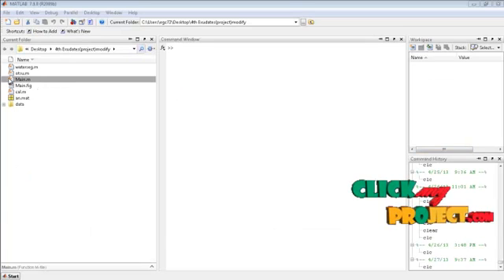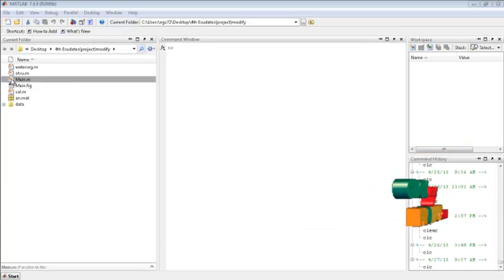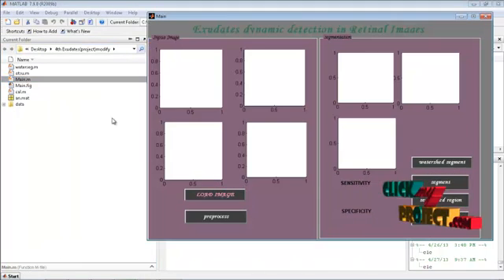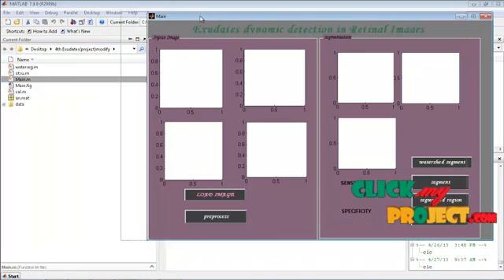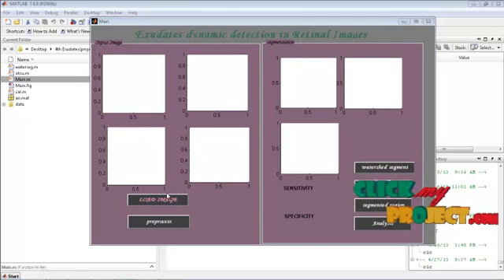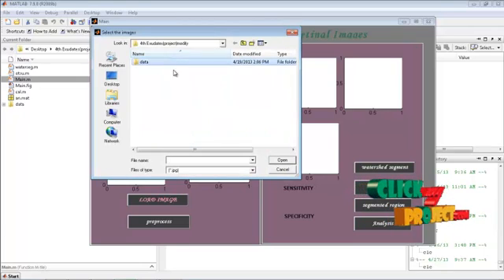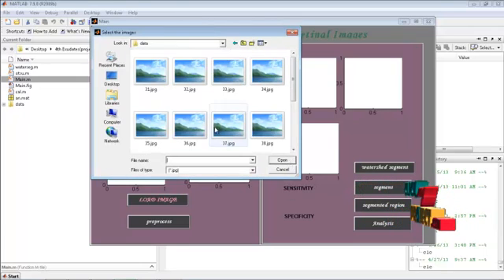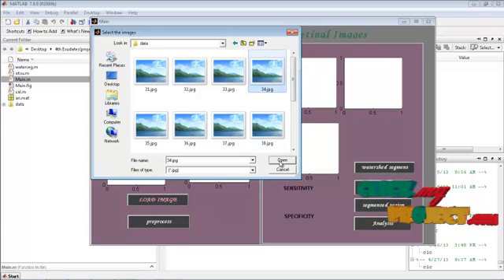Now, let's see about the execution part. I am having main.m file. Then select the file, right-click, run file. Then exudate dynamic detection in retinal fundus images. Then select the load image button. Here we have to select the input image.